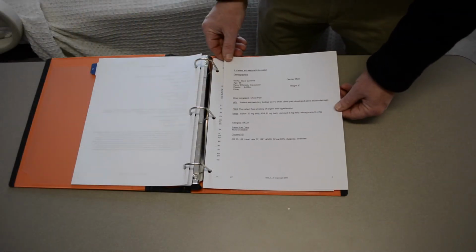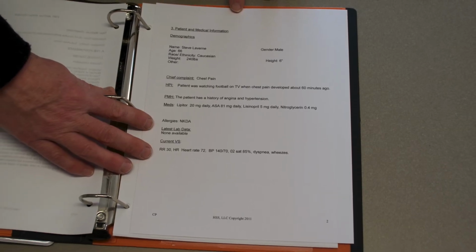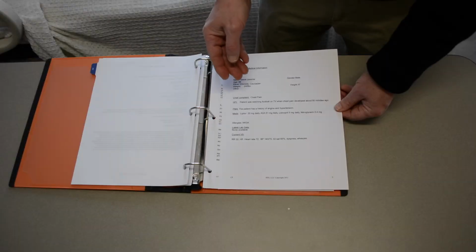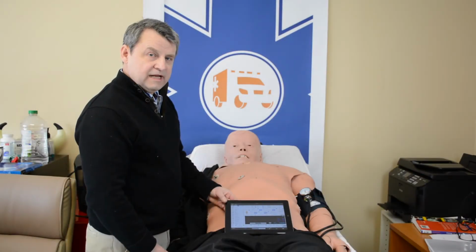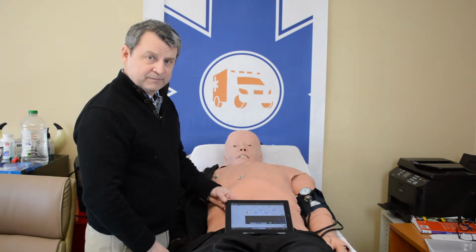A slight variation in the pre-performance section for the nursing scenarios is that we have included chart data, history of present illness, medications, as well as standing orders if those apply. We can now take a close look at the scenarios in action with the iPad and the mannequin running.